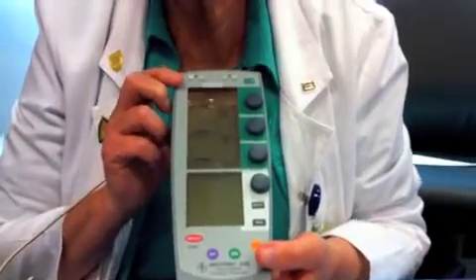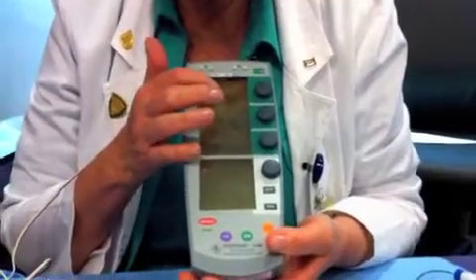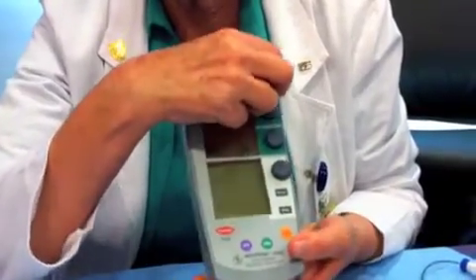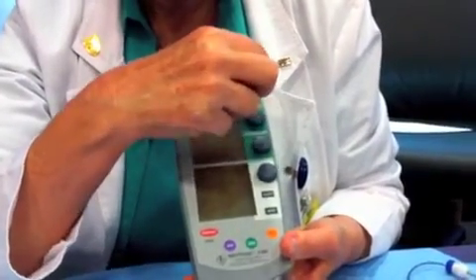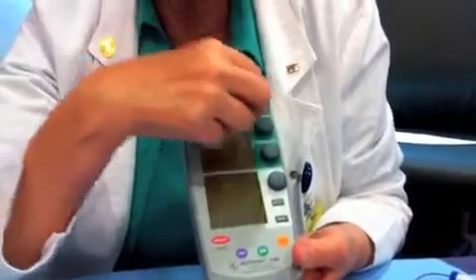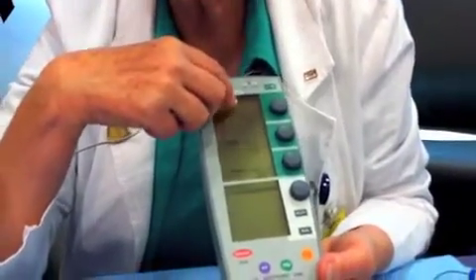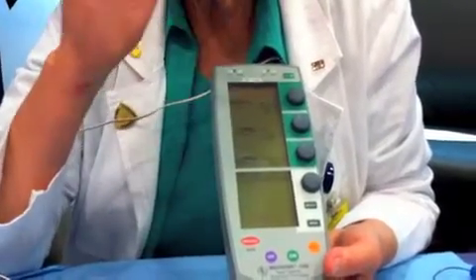There are a few defaults that this pacemaker has. It has a rate of 80 that it defaults to. The doctor may say he wants the rate at 75, so you can turn it counterclockwise to turn down the rate. It goes to either 74 or 76, so we'll give him 76. This is the rate — it's going to pace at that.